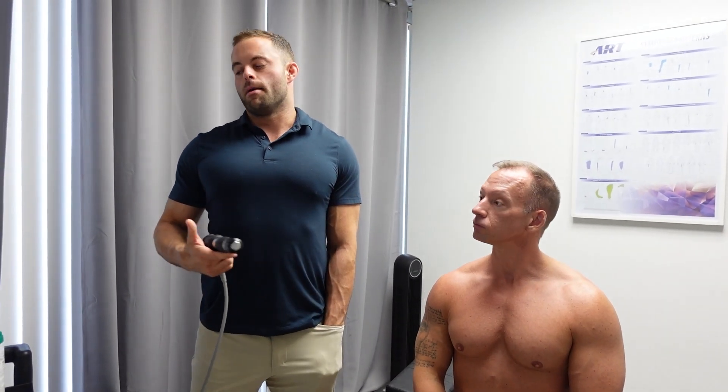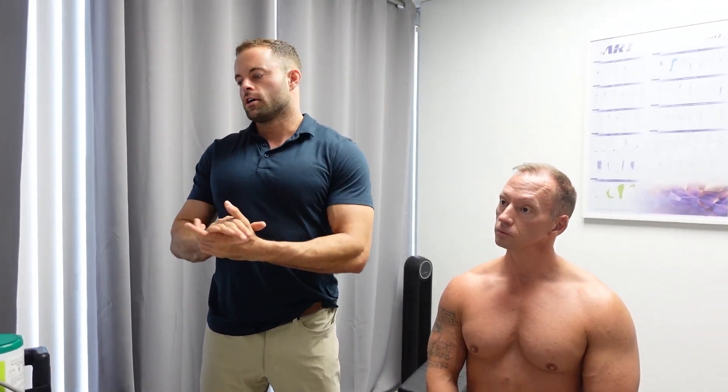If you're somebody that has plantar fasciitis, shoulder pain, knee pain, back pain, neck pain, muscle tears, or tendonitis, this is an incredible new tool that I use in my office. Of course, I still do the chiropractic adjusting and everything else — this is just another thing I'm offering to help you with your sports-related injuries. So if you or somebody you know has had a chronic injury, no one's been able to figure it out, and you've tried just about everything, come give the Shockwave a try — I'm sure it's going to help.